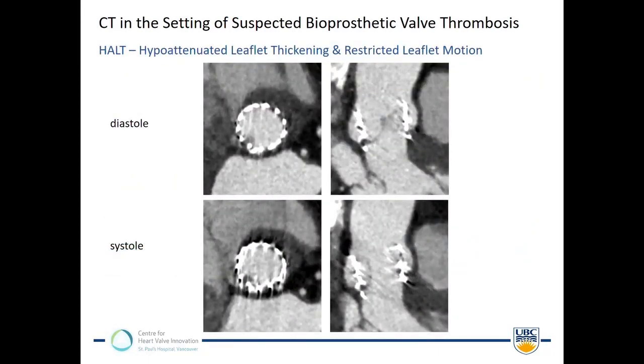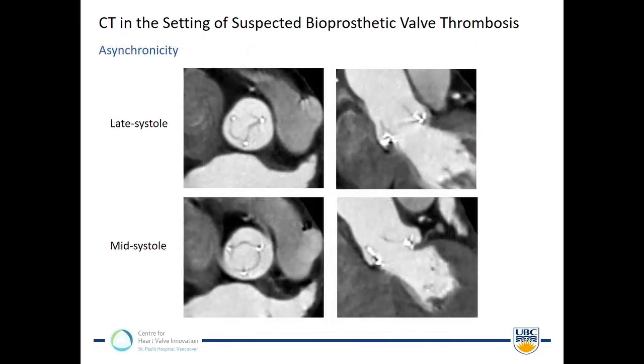So in this case here, obviously it's only the base. I would refer to that as less than 25% of thickening. Another reader may perhaps interpret that as 25 to 50, but nobody is going to call this more than 75% leaflet involvement. So in terms of leaflet restriction, that's a very difficult topic.